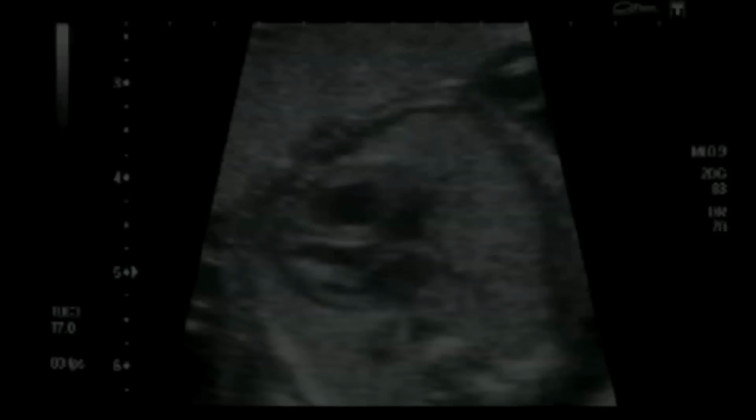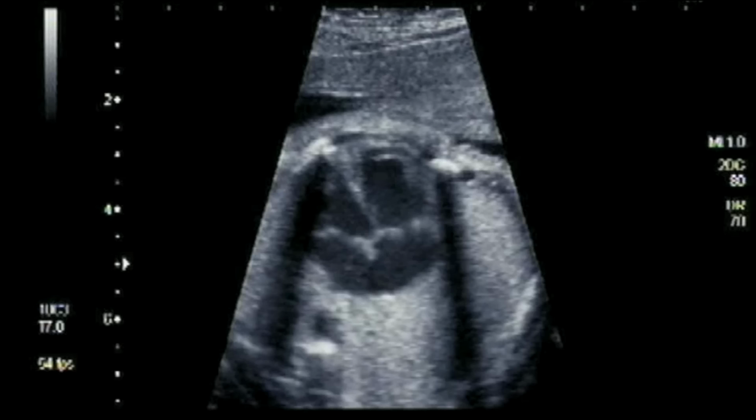So when it comes to holding the probe, it makes sense, first of all, to steady your arm on the patient. The other thing that you have to get to know and love in fetal heart scanning is artifact. Artifact you have to use to your advantage, and it is easily illustrated in the two examples that follow. In the four-chamber view, as shown, the interventricular septum looks really thick and chunky. And this here is another picture of the same fetal heart taken on the same day, where the four-chamber view shows the interventricular septum looking really thin.